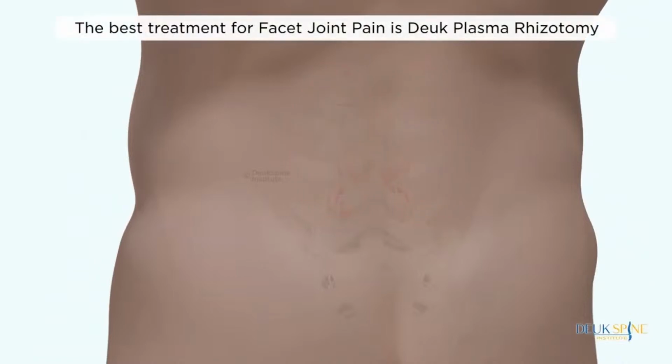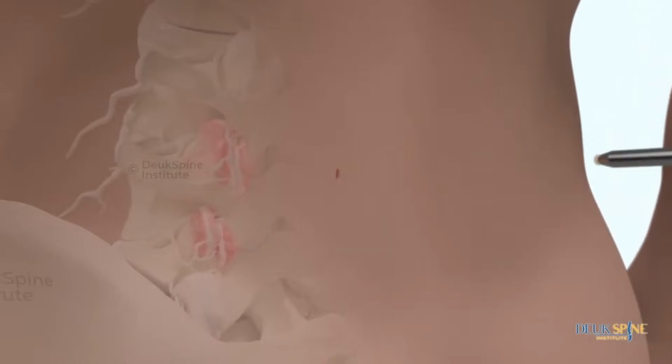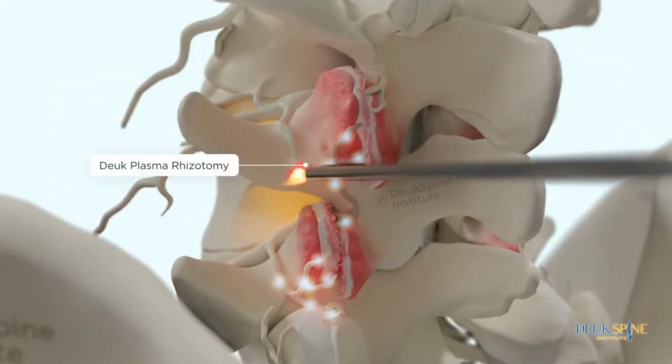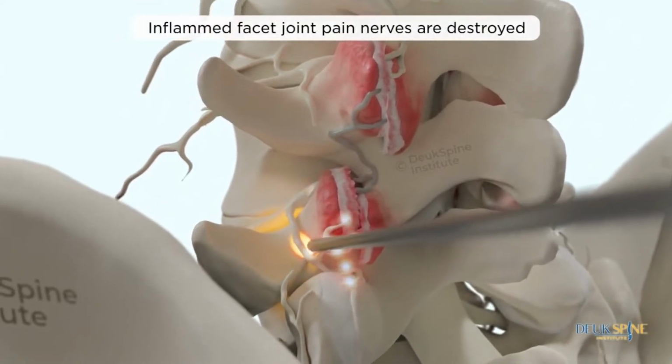The best treatment for facet joint pain is the Deuk plasma rhizotomy. Inflamed facet joint pain nerves are destroyed.